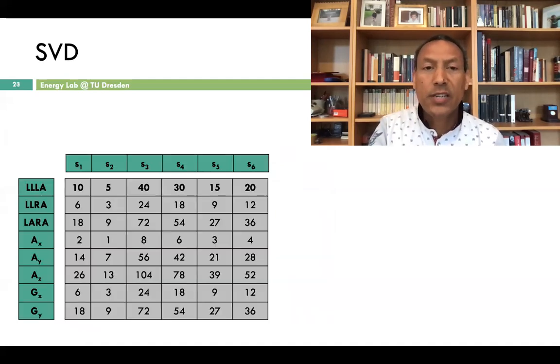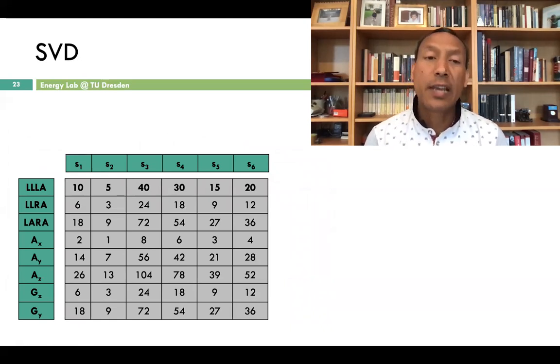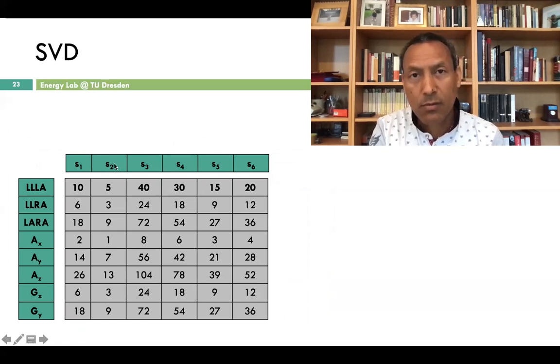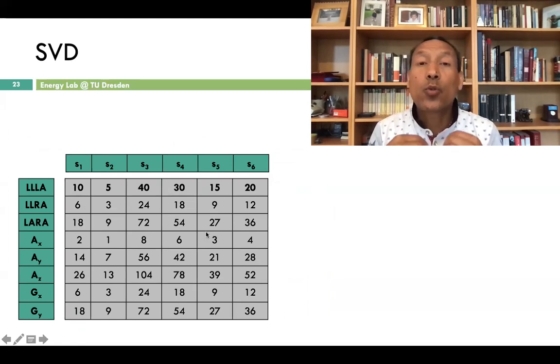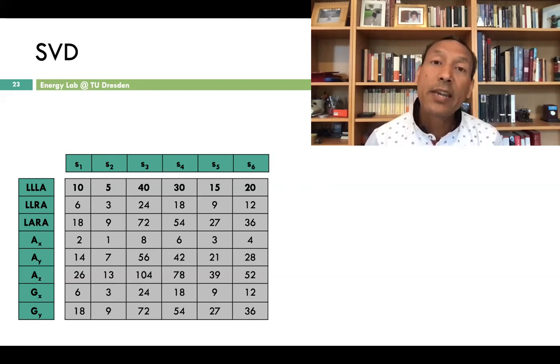So here you can see it's just two-dimensional. Suppose the raw data here is now time data, a time series. Suppose we wish to also take a look into the spectral aspect of the data. That means now we need an additional dimension.